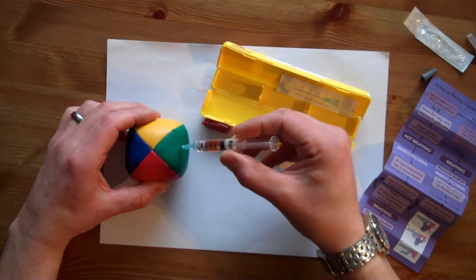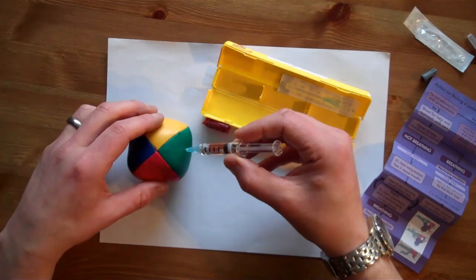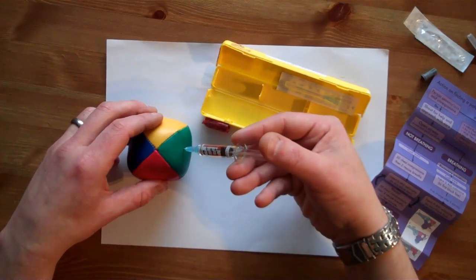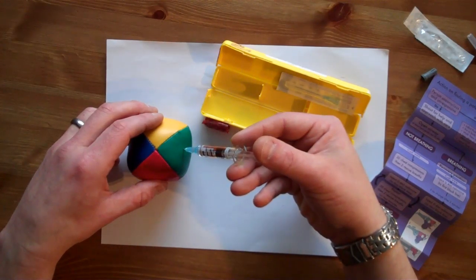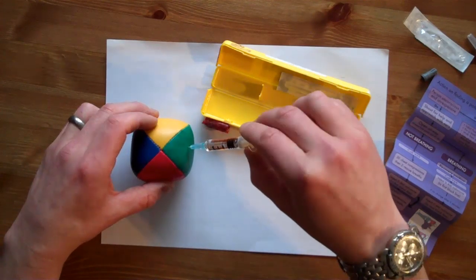We can rotate the barrel to find these black marked lines which each one indicates a dose. We then push down to the first black line and that's administered 0.4 ml of naloxone into the casualty.